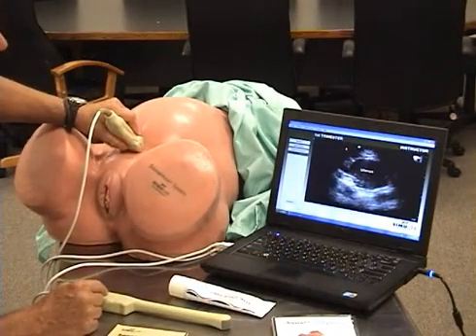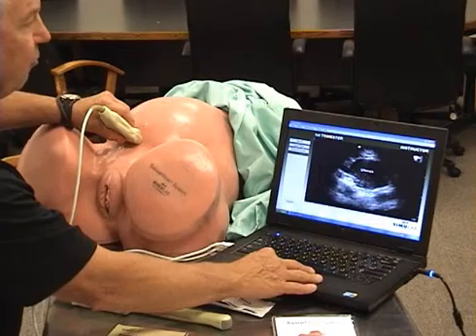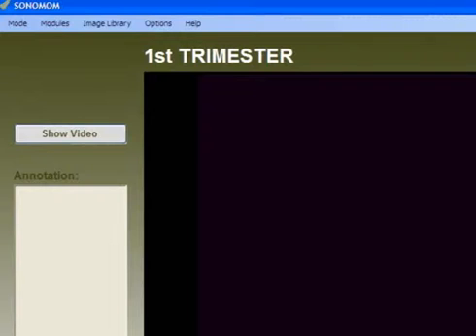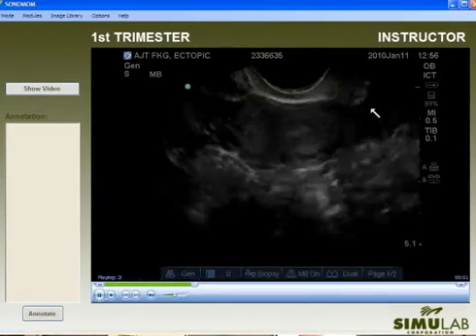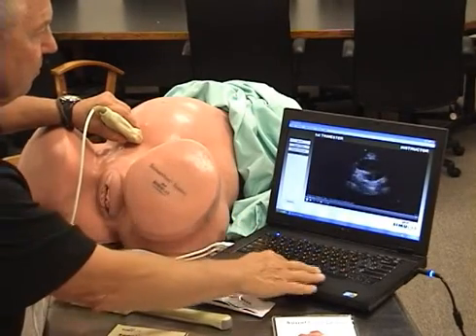So as I get into this zone for doing the diagnostics, you'll notice on the left here that you have a show video option. And holding the probe in this location, you can have a loop that will show a constant loop showing what that patient is, the diagnostics or the scan of that patient in a dynamic view.